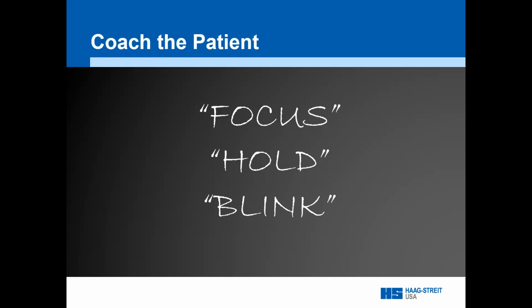Then immediately after the scan is completed, I'll repeat focus, so that the patient quickly refocuses, making it easier for the Lenstar to begin the next scan. You see, the Lenstar needs to see the visual axis reflection in order to scan. It's only scanning when the scan is appropriate.